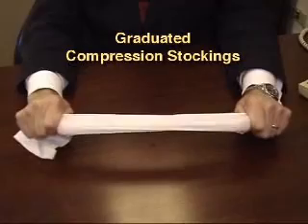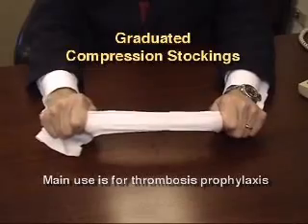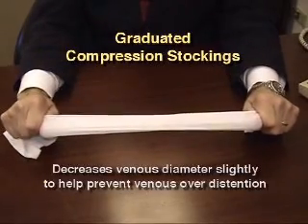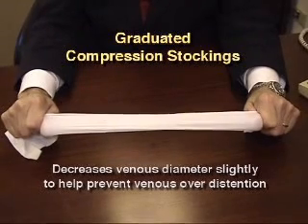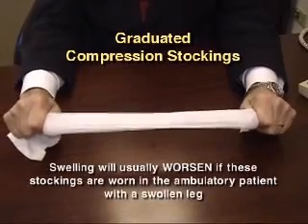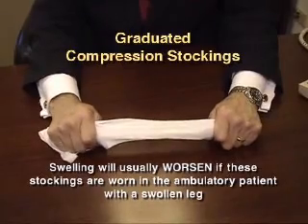Antiembolism hose are widely used and commonly referred to as surgical stockings. These products are widely used following surgical operations and are designed to help prevent blood from pooling in the leg when the patients are at bed rest. These stockings have an average pressure of 8 to 18 millimeters with a downward gradient from the ankle to the thigh to help promote flow of blood up out of the leg toward the heart in the bedridden patient. They do not work as well in the ambulatory patient since their pressure is not great enough to overcome the ambulatory venous pressure, particularly in patients who have venous disease of the lower extremities.